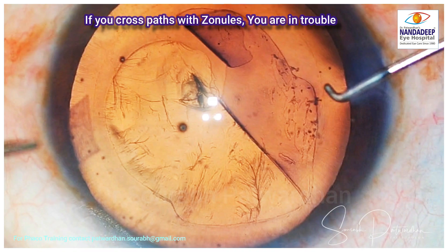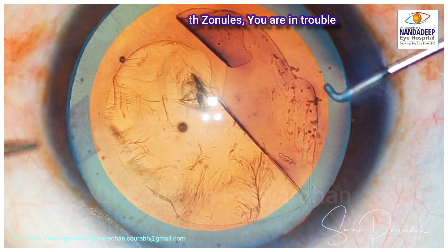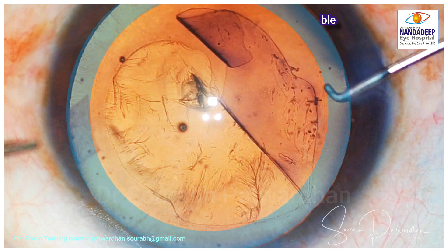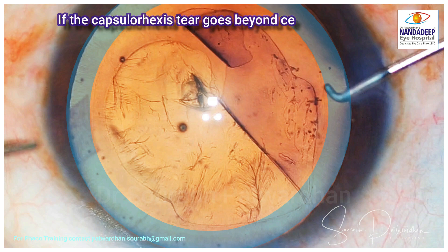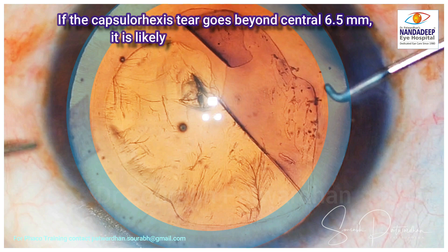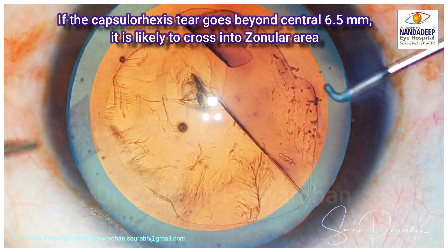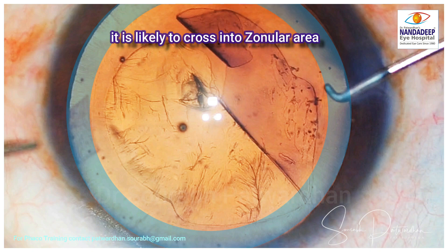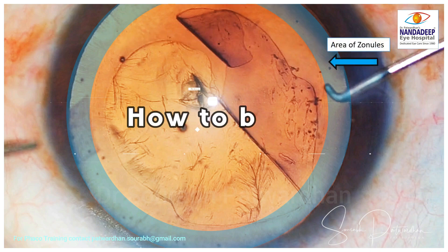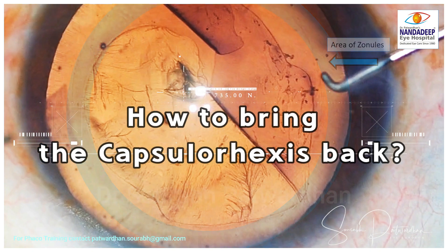It's best to avoid crossing paths with the zonules. Whenever the capsulorhexis goes beyond the central 6.5 mm, it is likely to cross into the zonular area, and once the tear is in the zonular area there is a high chance of extension beyond the lens edge. So how do we bring the capsulorhexis back?